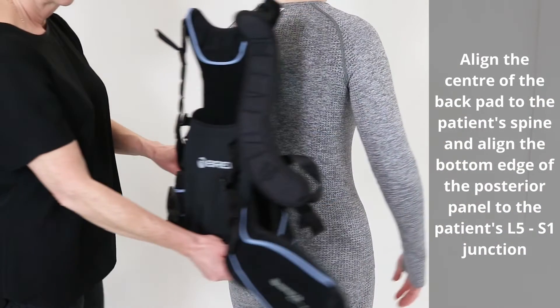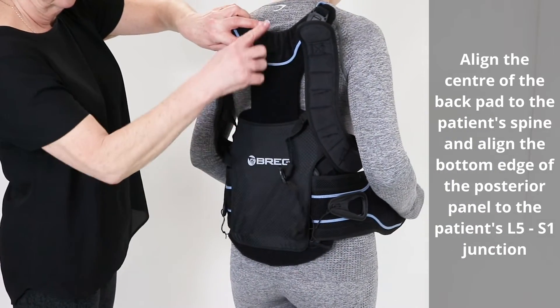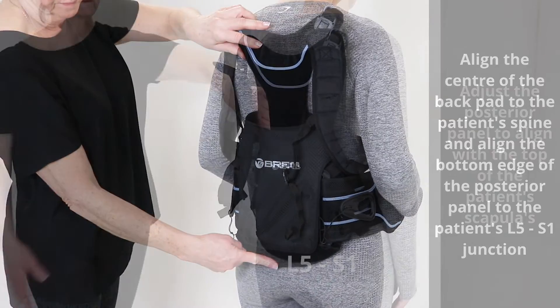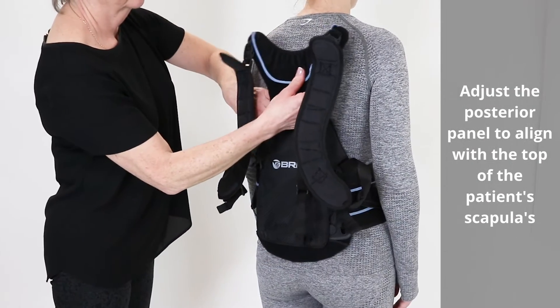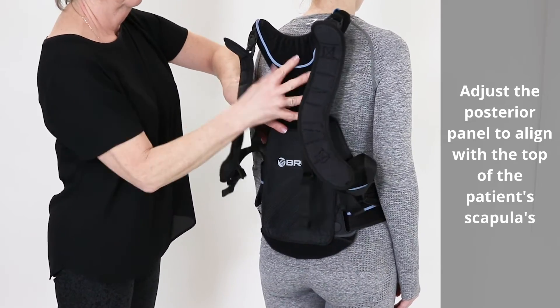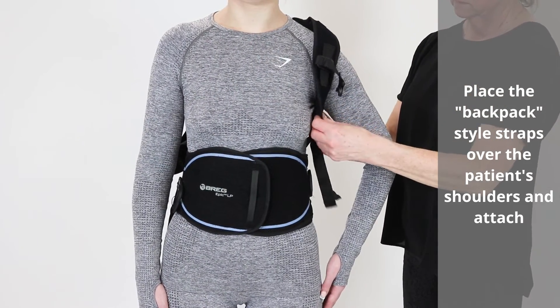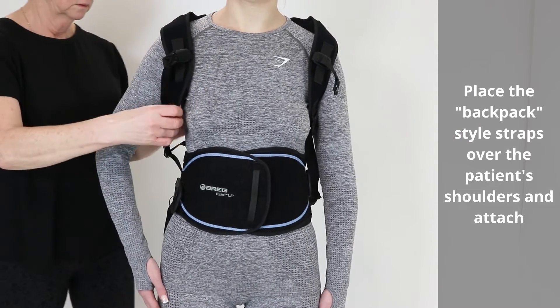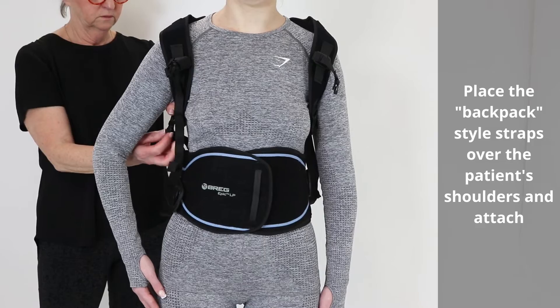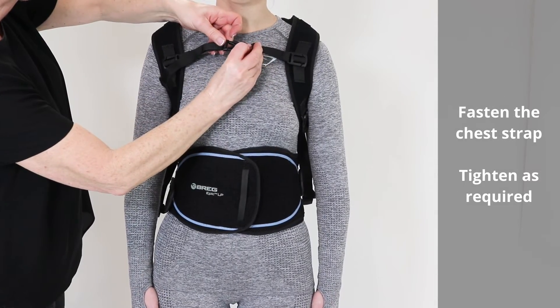Align the centre of the back pad to the patient's spine and align the bottom edge of the posterior panel to the patient's L5-S1 junction. Adjust the height of the posterior panel to align the top edge with the top of the patient's scapulas. Place the backpack-style straps over the patient's shoulders and attach. Fasten the chest strap and tighten as required.